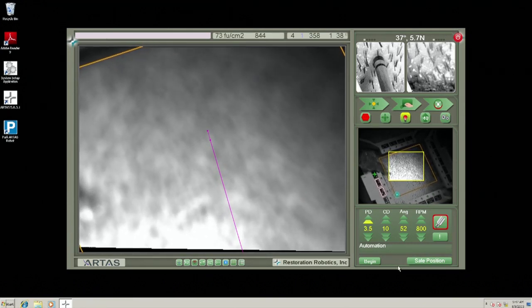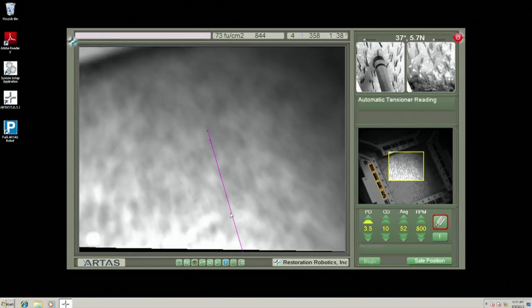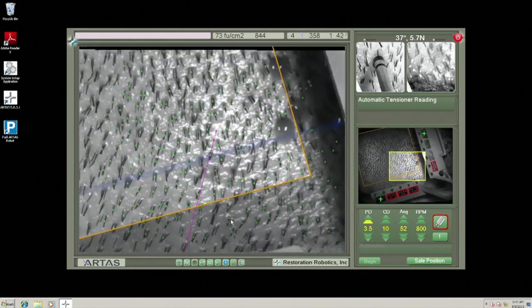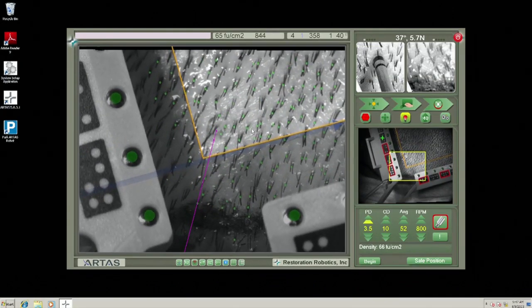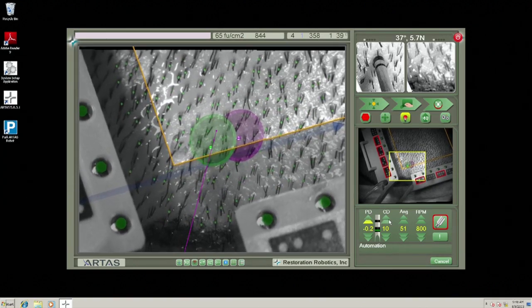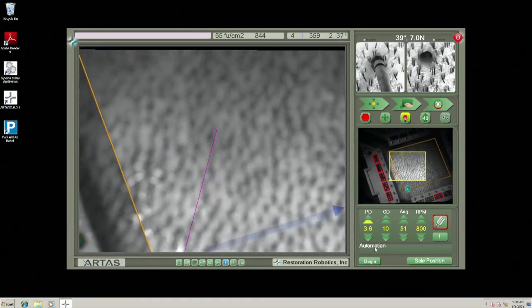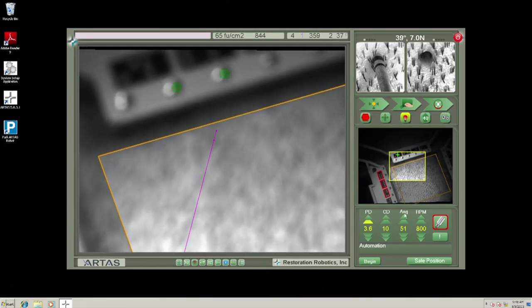We were doing it on a case-by-case basis as recently as probably about a year and a half ago. And then we came to realize that cases that get poor growth, which happen maybe as frequently as 1 in 50 or 1 in 100, those patients might have had a difference. They may have had something that was a noticeable change, but we don't know which one that's going to be. And so I think that in itself is probably worth being able to really investigate by employing PRP across the board.